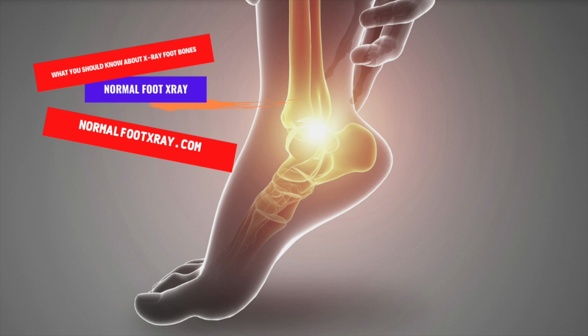Anteroposterior views are the most common. Lateral views of the foot are also commonly used. Having the proper view will help a doctor understand the severity of any problem. A normal X-ray of the foot is a vital part of diagnosing any bone injury.